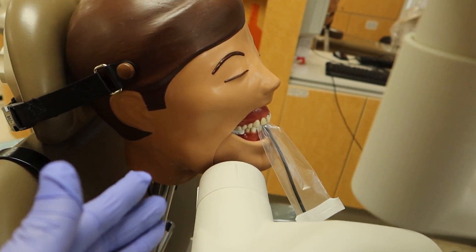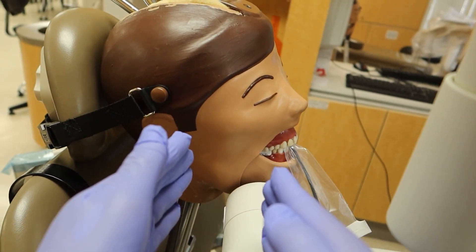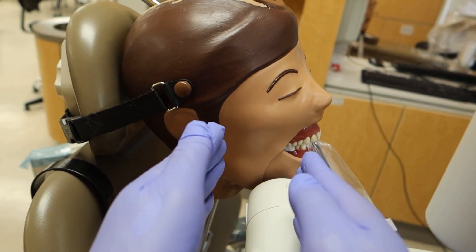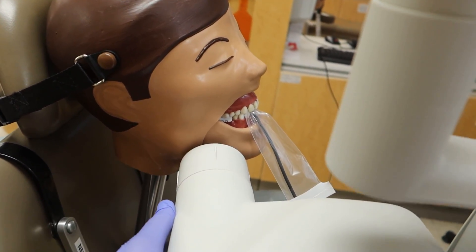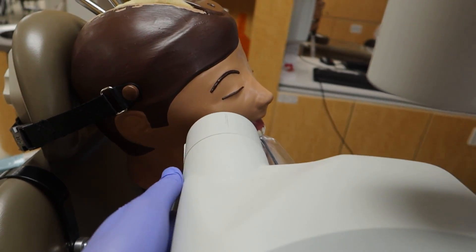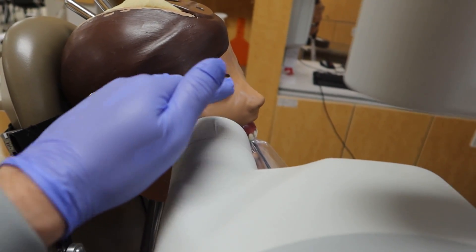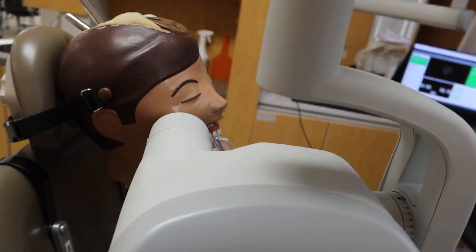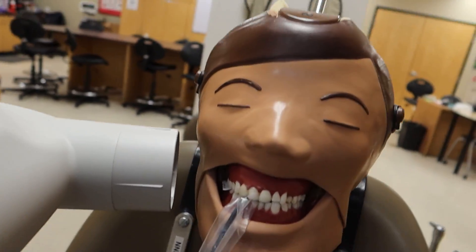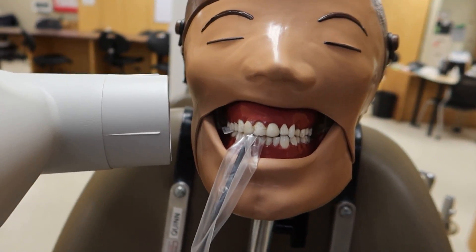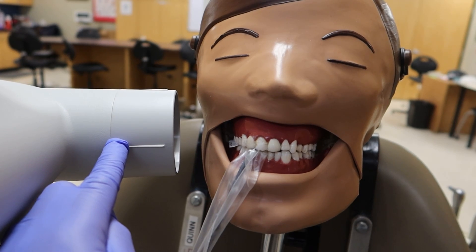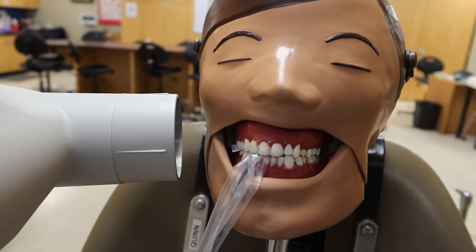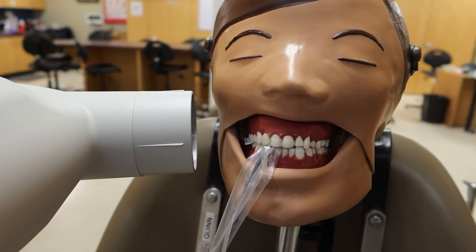Cool. That's my center. Now I need to position it. What type of tooth am I aiming for? Molars or premolars? Well, like I said, molars are the outer side of the eye. So I have my centering, I have my positioning. Now I can just go ahead and raise it up so that I have half of my x-ray beam for the top teeth, half the x-ray beam from the bottom. From a side view, it looks just like so. Half the beam is up, half the beam is down. The smile line that we have on this person matches the horizontal line right here on the side of my PID. And I can go and take my x-ray.